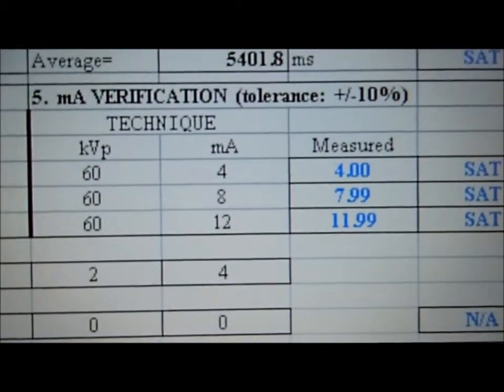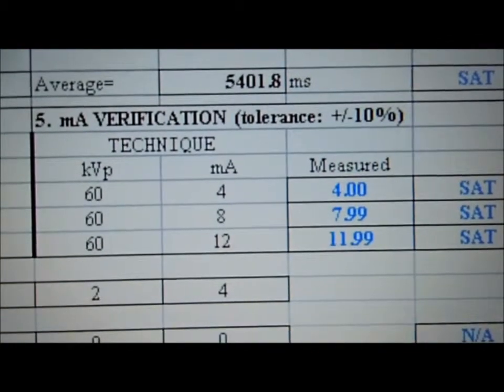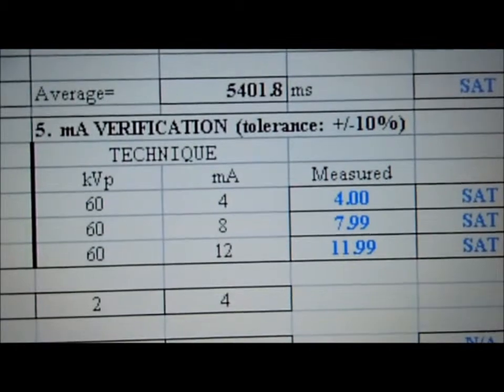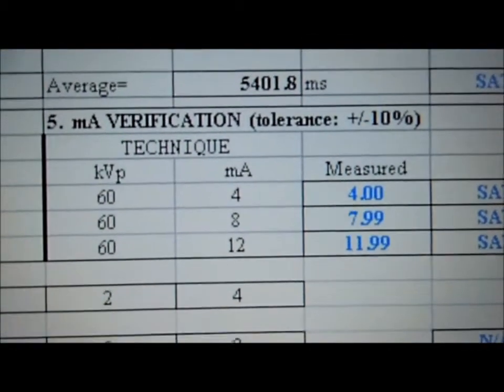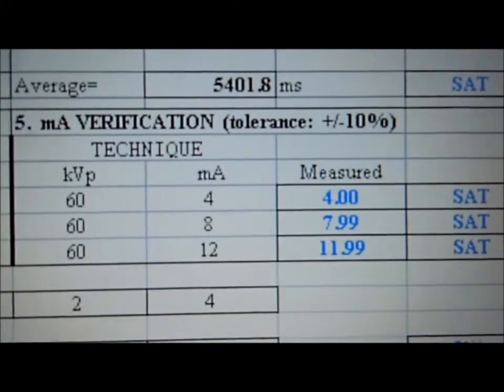Why is mA quality so important? mA quality directly impacts the quality of the image and patient dosage for the purposes of radiation protection and assessment or risk of radiation overexposure to the patient.